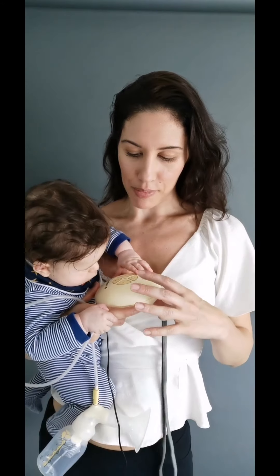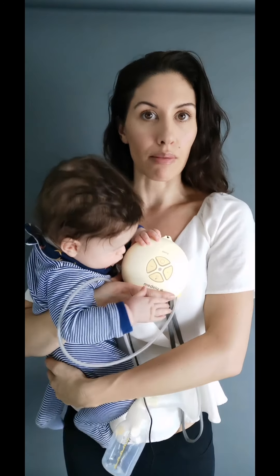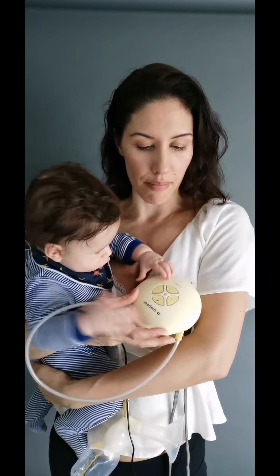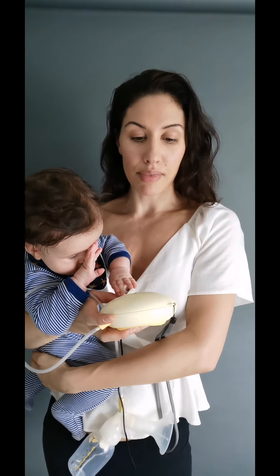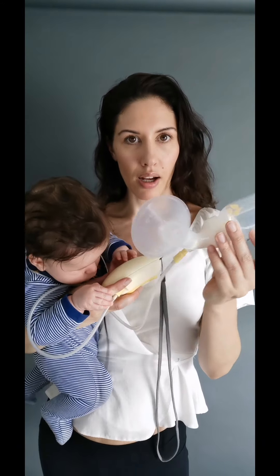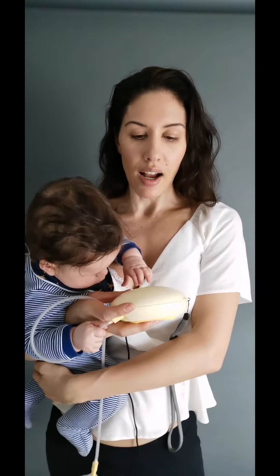To recap on the Medela Swing pump — is it portable? Yes, it's pretty light. I've taken it to Ibiza, to Wales, to Oxfordshire, and I took it on a job to a studio the other day. Even with all your bottles and bits and bobs, you can carry it about. It also has a battery compartment, so if you don't have anywhere to plug it in it is very portable with batteries.